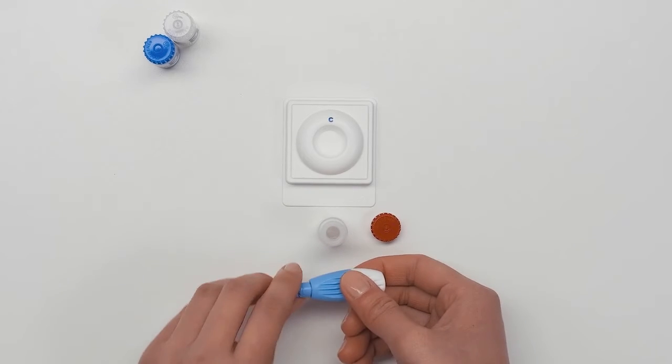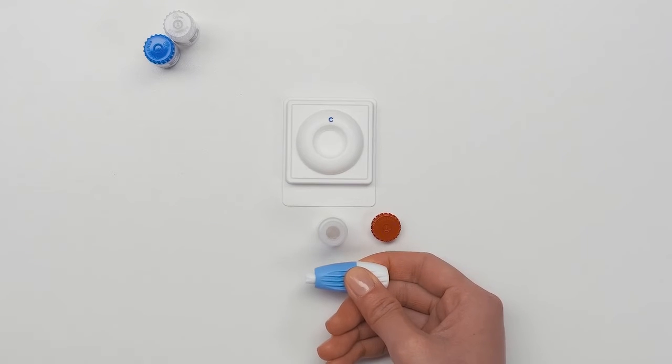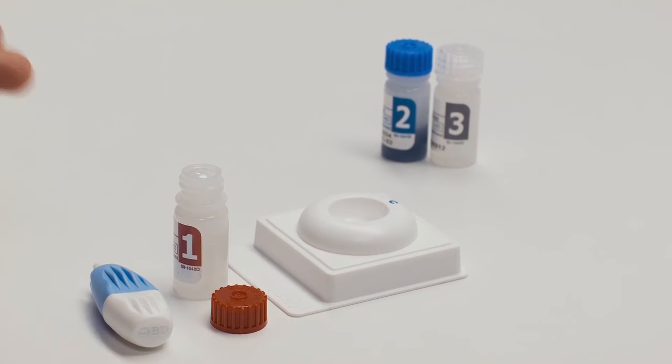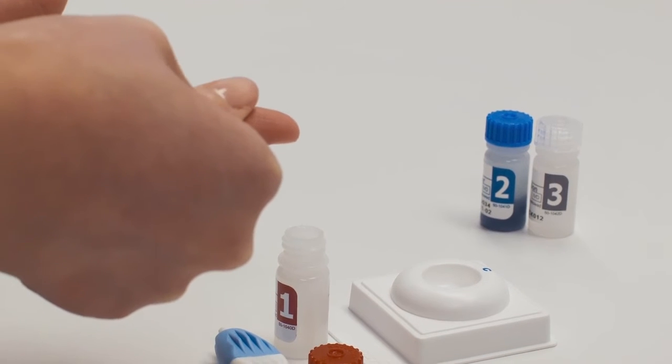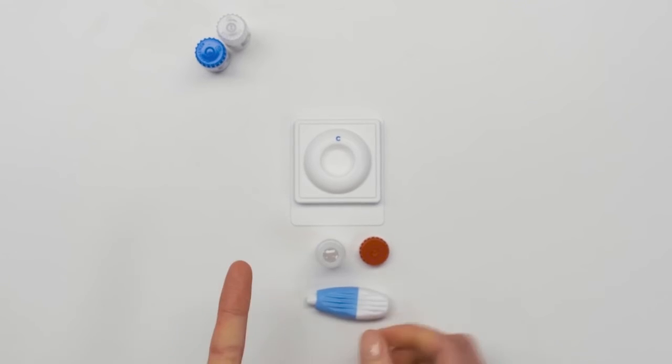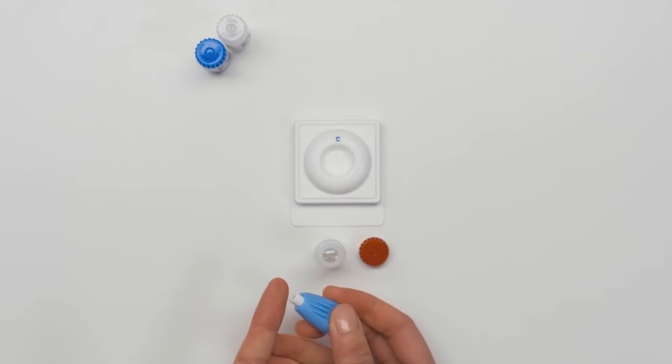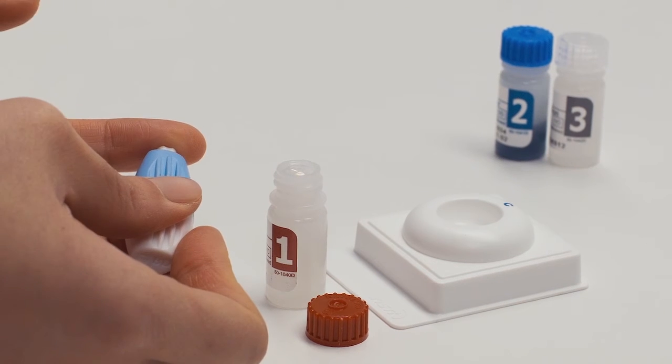Twist and pull the blue tip out of the lancet and place aside. Rub your finger until warm. Place the lancet on the side of your fingertip. Press hard until you hear a click.